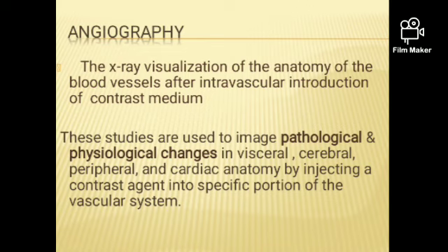Clear? So once you are using the X-ray modality, your high-density structure will always show bright because that is a negative image. But when you are using fluoroscopy live mode, any higher density structures will show black because that is the positive image we get.